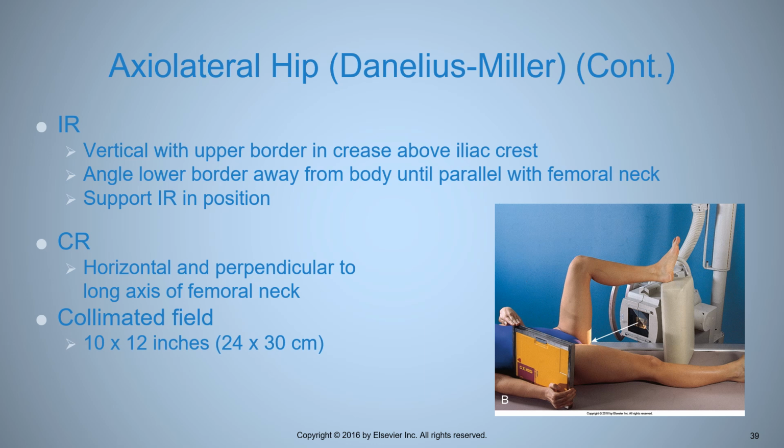So yeah, the unaffected leg is the one that's raised. You guys remember that for your practical, because you'll draw this and you'll fail your practical because you raised the affected leg. You're raising the unaffected leg. You're aiming at the affected leg, which is remaining horizontal and non-manipulated. The patient can hold the image receptor in most cases. If they're unable to do so because they're unconscious, then someone is going to have to hold this image receptor in real clinical practice.